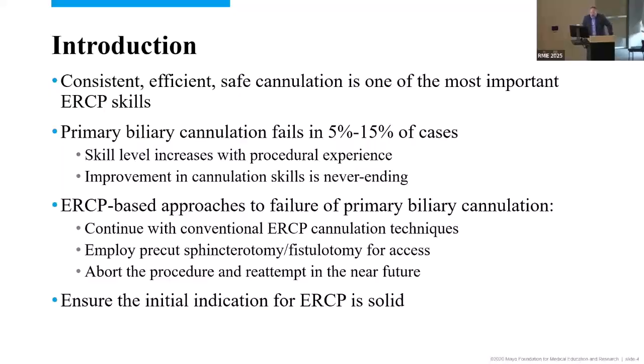We do know that skill level increases with procedural experience. So hopefully for all of us, our cannulation rates continue to improve. Improvement, as I stated to the fellows the other day, is really a never-ending skill. You can always get better. You can always pick up new techniques and new skills.